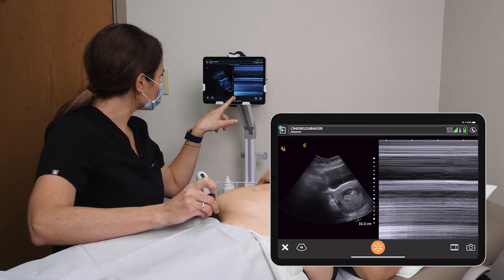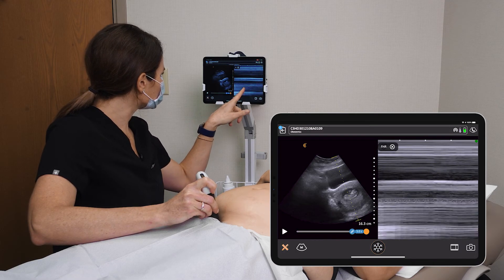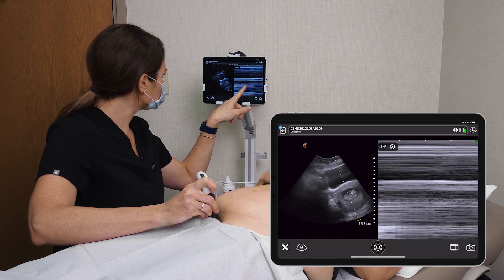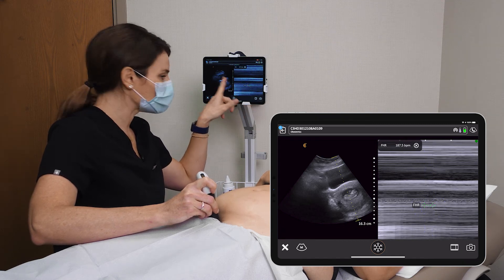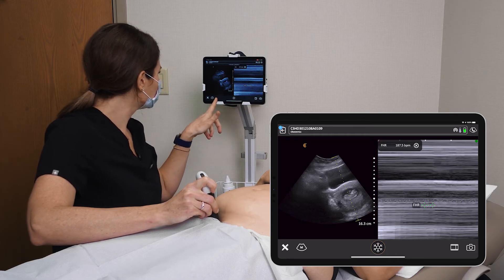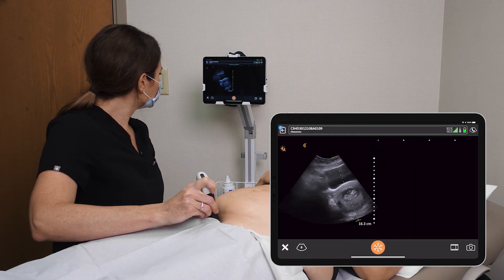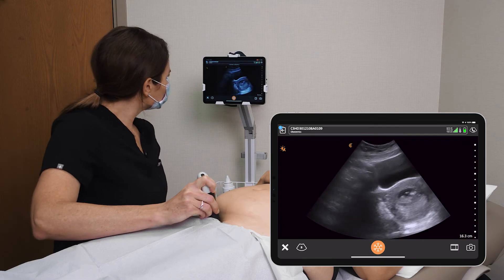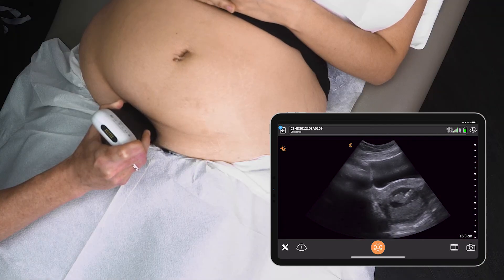Excellent. Once I have a nice image I can freeze and go to my tools and measure the fetal heart rate — 180 bpm, which is normal in the first trimester. And then we're going to switch back to B-mode. Excellent — have a look here.